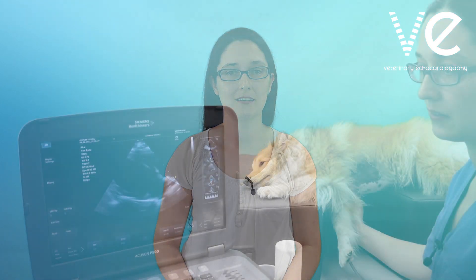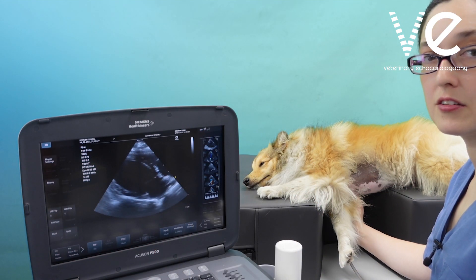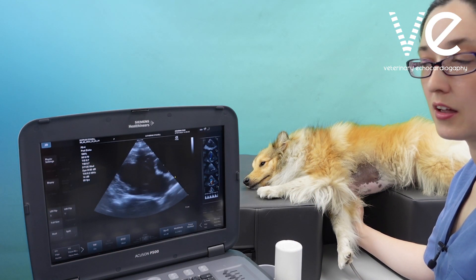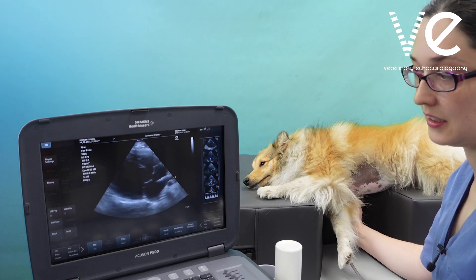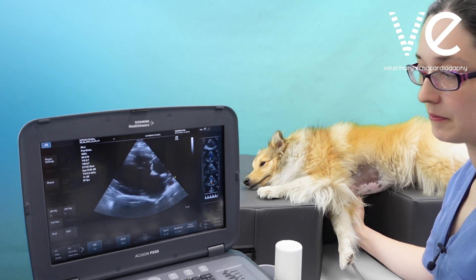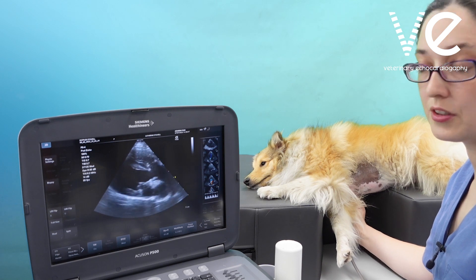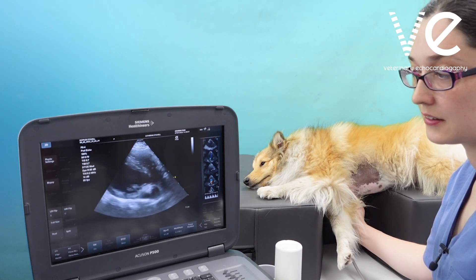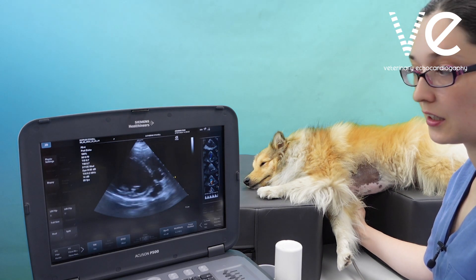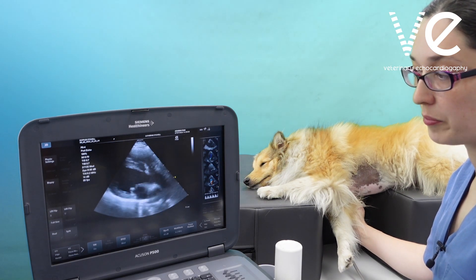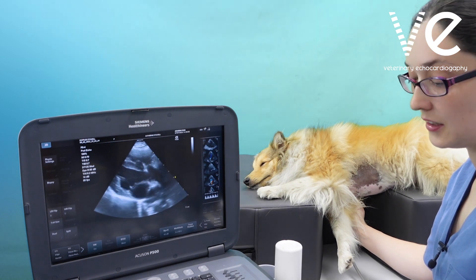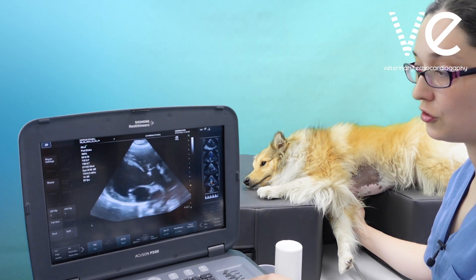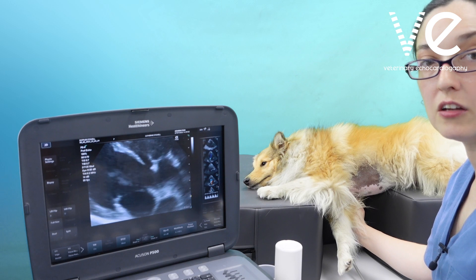In today's video we're going to share a few tips for assessing the severity of aortic regurgitation. From the right parasternal four-chamber view, look for signs of left ventricular dilatation, then rotate your hand to open up the left ventricular outflow tract and visualize the aortic cusps. Check for any signs of prolapse or endocarditis. It's a good idea to zoom in over the valve so you can look closely.